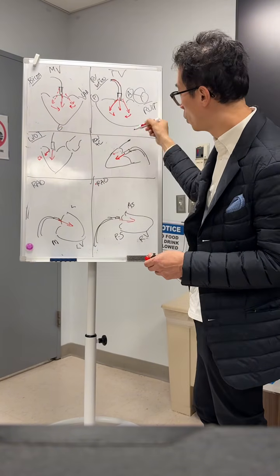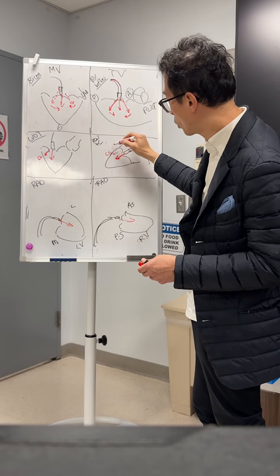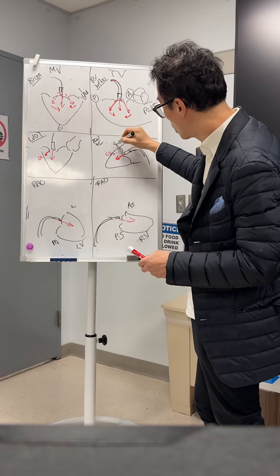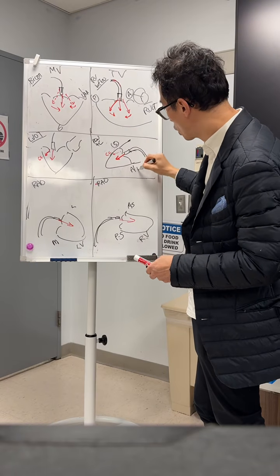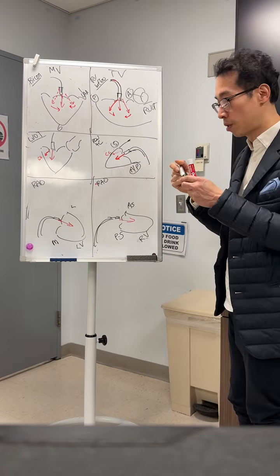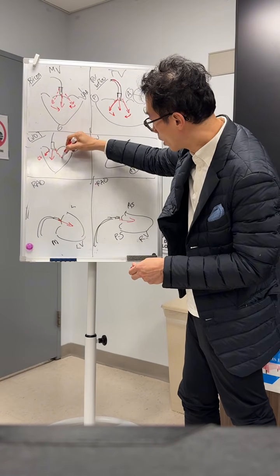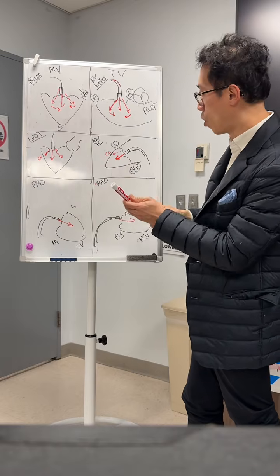Same thing here. If you go in, you're doing septal. This is septal, just to be sure everyone knows orientation. And this is A versus P. It depends on where you are. And if you're going anterior here, let me just mark this.